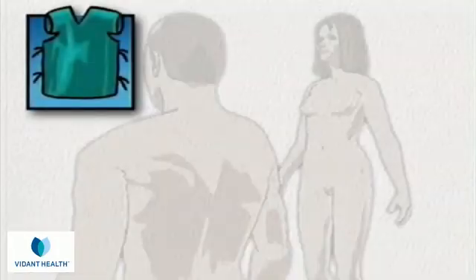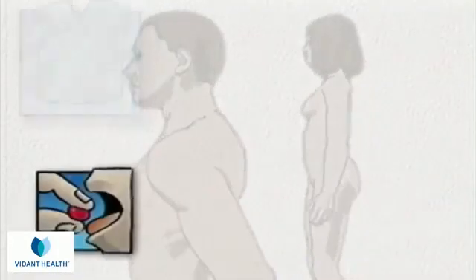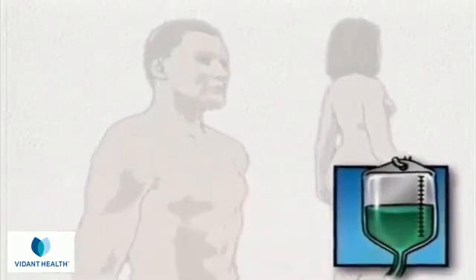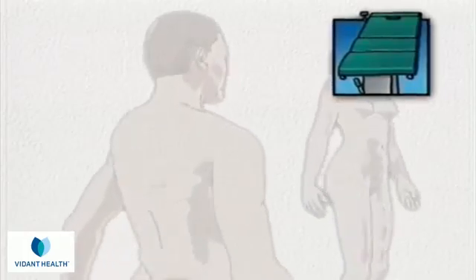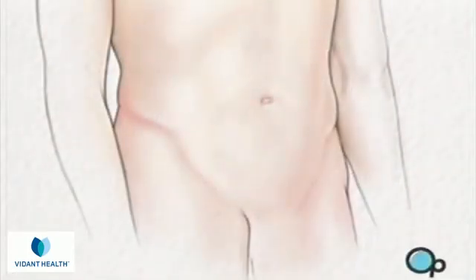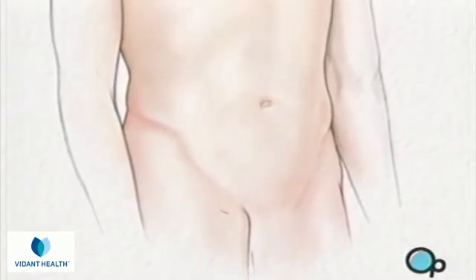On the day of your operation, you will be asked to put on a surgical gown. You may receive a sedative by mouth, and an intravenous line may be put in. You will then be transferred to the operating table. To begin, your leg and groin are swabbed with an antiseptic solution. Then the doctor will make a small cut over the femoral artery in the upper part of the leg.